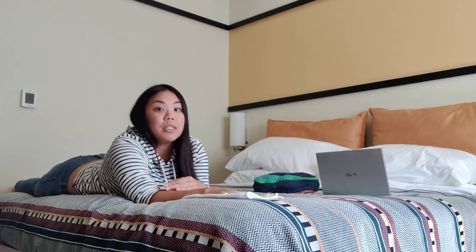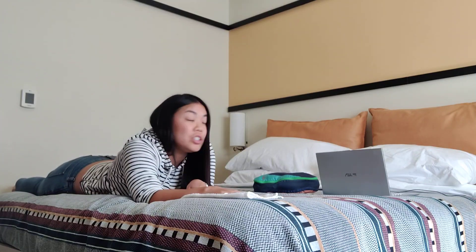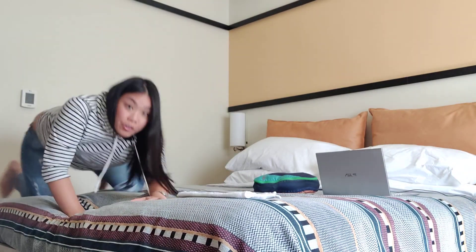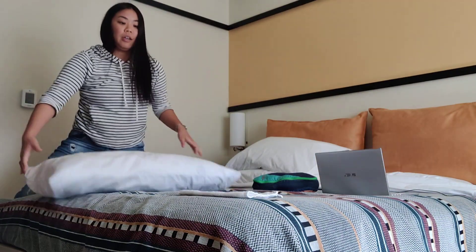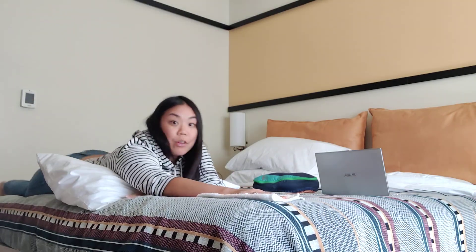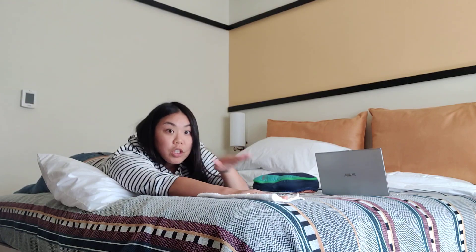Sometimes it's good to have a pillow, because some patients are older and can't hold the position. Grab the pillow, put it under their chest area, and then they'll reach out. You can move them up or down, or have the patient move lower so they're in that Superman position.